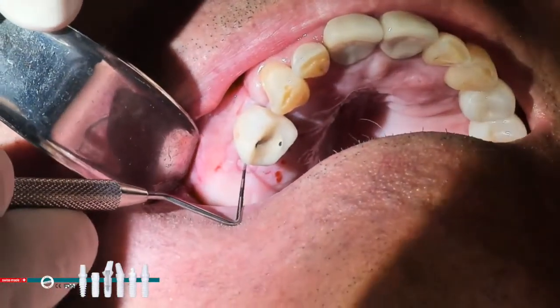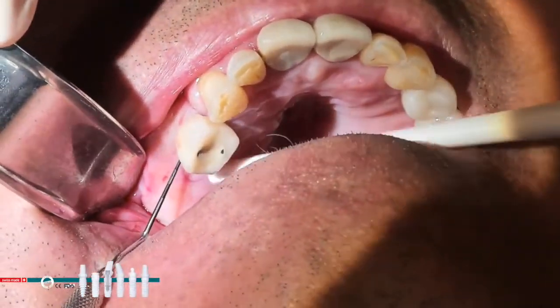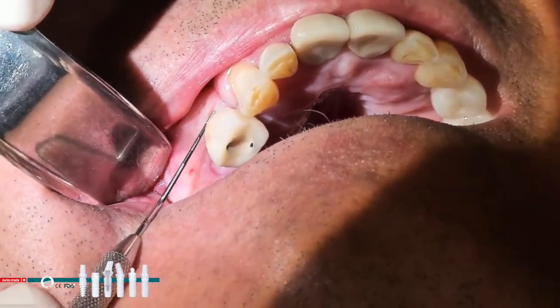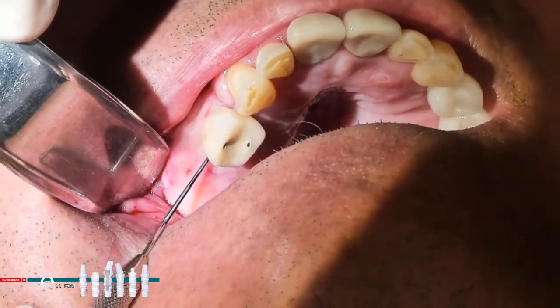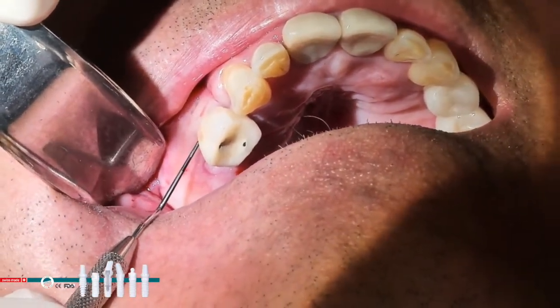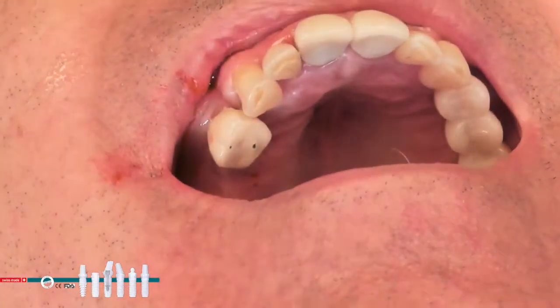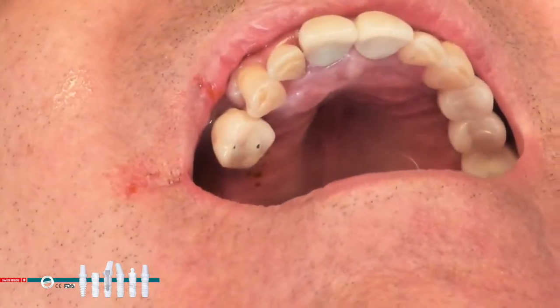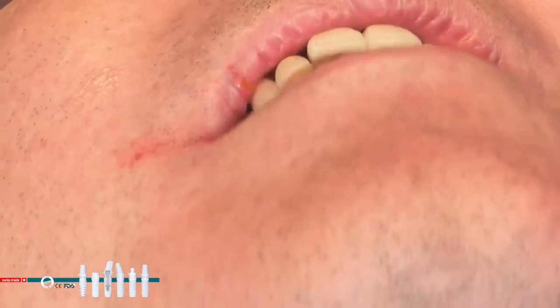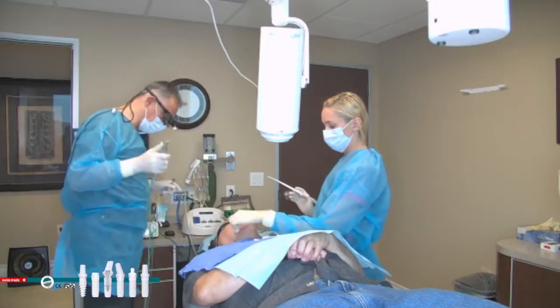And then with your probe, you mark in the center of that marking in the gums, and then you do a little measurement to check your distance next to the other implant or the other crown. So he has a large premolar on this existing titanium implant. So we're going to do another zirconia implant next to it, probably similar to the size of the crown. So you can do your marking right through the gum with the smallest drill.